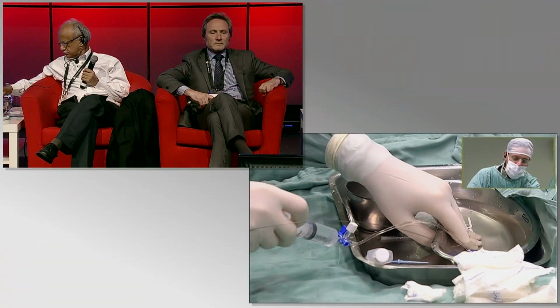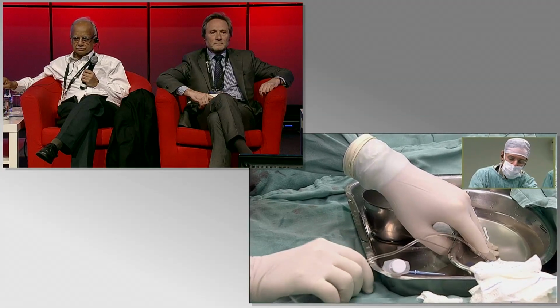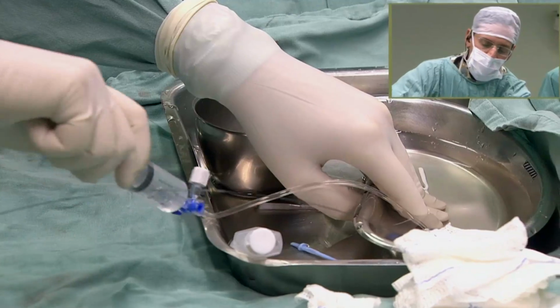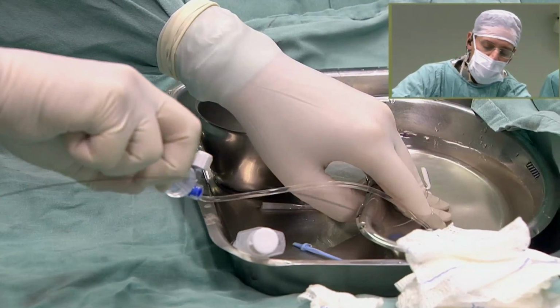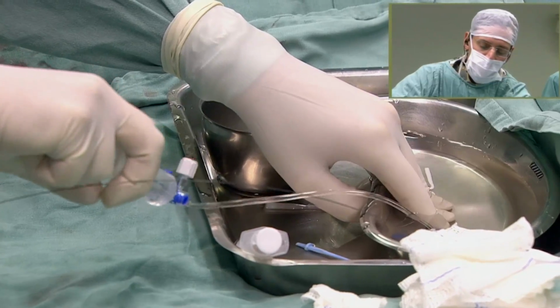Carlos, this is Franz Freudenthal from Bolivia. We have these large devices in La Paz, and what we do is we take the device in the hand and try to make it smaller, like in the ductus, and you're going to see that the retention disc is going to be also smaller.